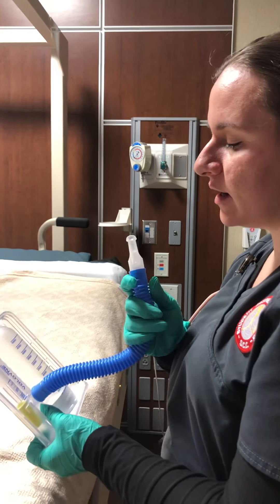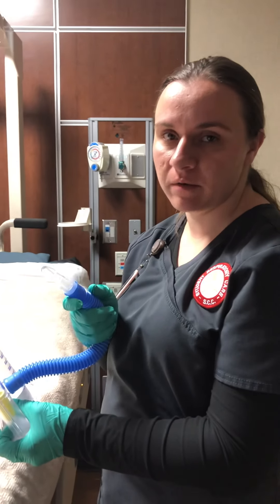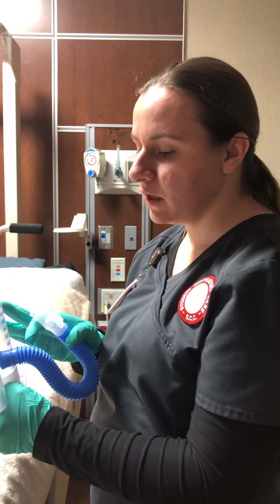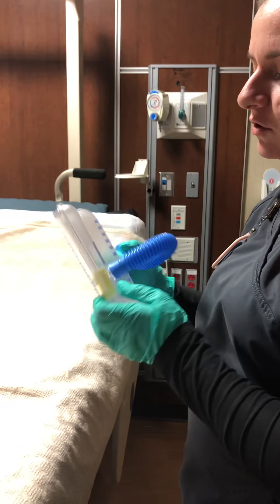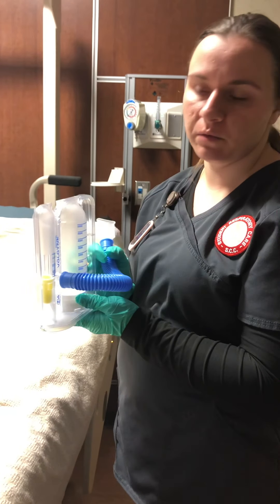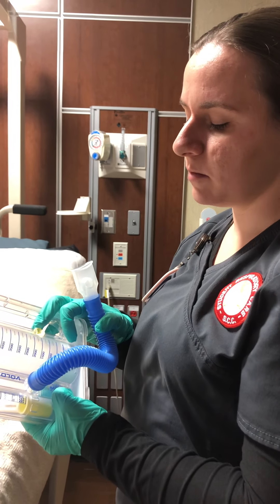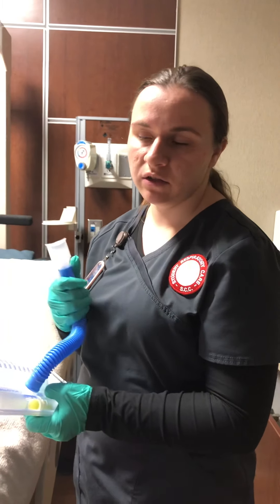When they exhale after the breath hold, have them exhale away from the mouthpiece so they're not blowing moisture or air back into the machine. Before using the volumetric exerciser, always check it to make sure there are no cracks. If there are any cracks, replace it with a new machine. If the patient didn't quite reach the appropriate level, start them at a lower rate and work them up to where they need to be.